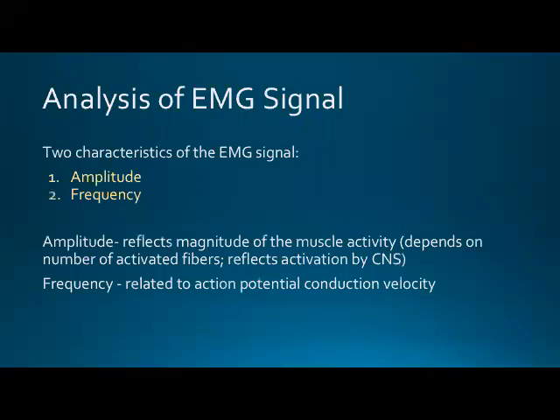So when we're analyzing the signal, calculus aside, because calculus is definitely involved in the interpretation of the EMG, that's why I said find someone in engineering who loves math, because all of those analysis softwares are basically calculus equations deriving different areas of the curve and then calculating the different electrical effects and distance to or from the innervation zone.